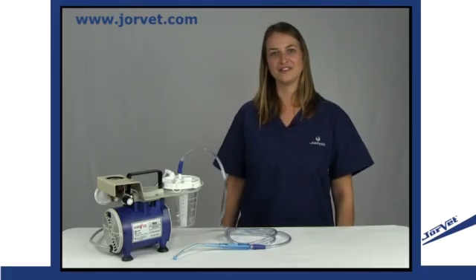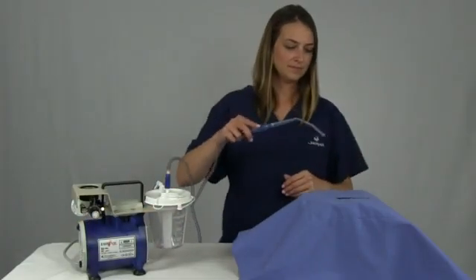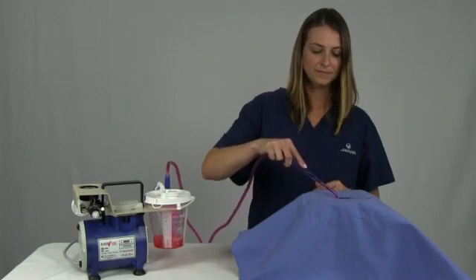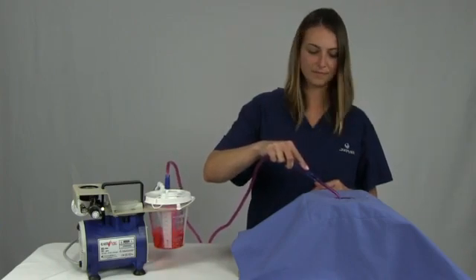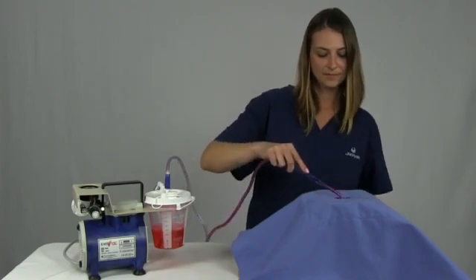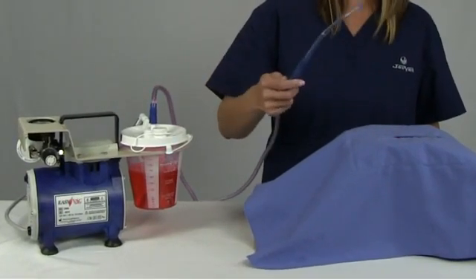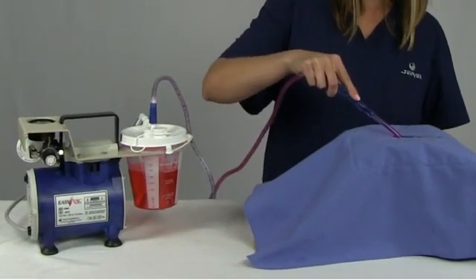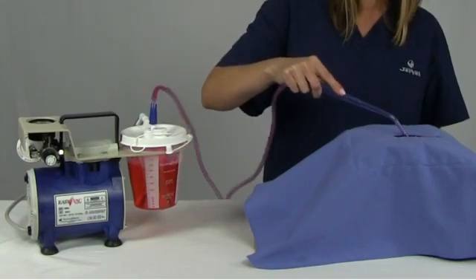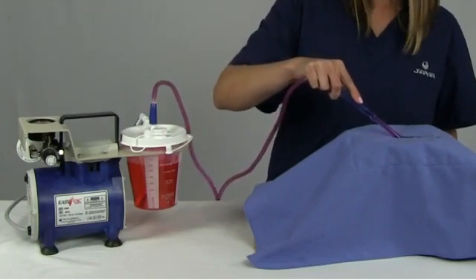Let me show you how effective this unit is at suctioning. I have here some fluid that I will be using for demonstration purposes. As you can see, we have elevated the fluid because ideally for this machine to work effectively, the machine should be at a level that is below your patient. Both the canister and the suction hose are disposable, but be sure to empty the canister in a proper biohazard receptacle. For this reason, plan ahead and be sure that you keep these items in stock so you don't run short.